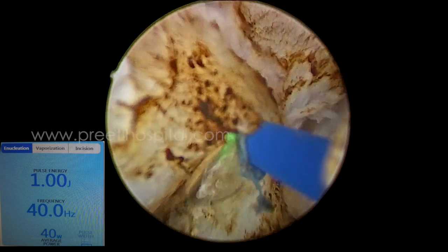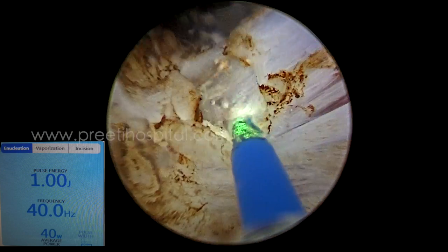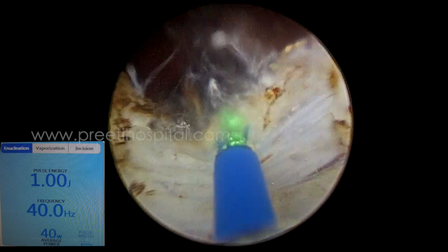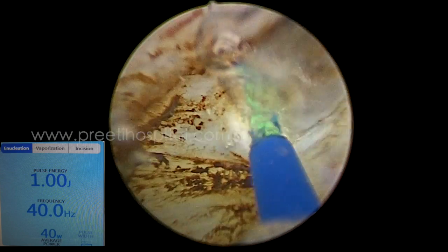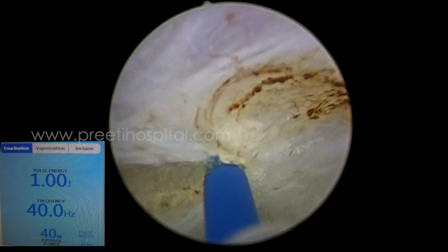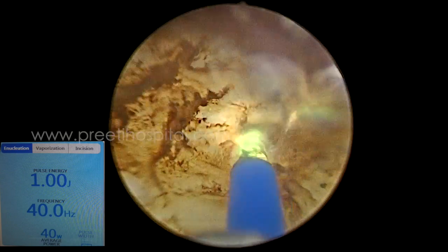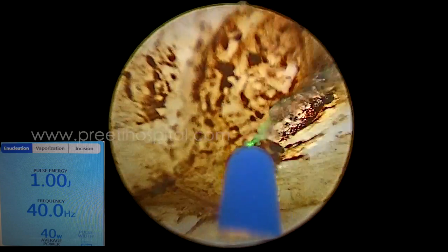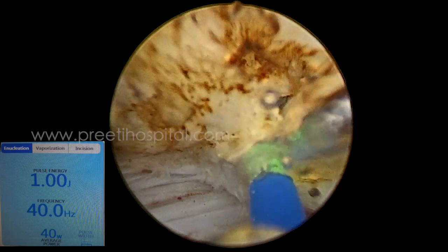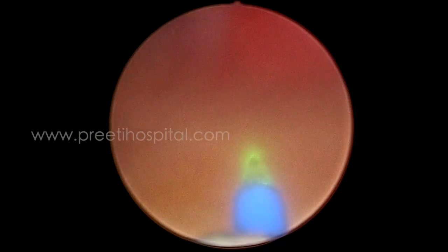During that process the prostate was hanging into the lumen of the bladder. This is the area of the bladder neck, now very closely coming at the 6 o'clock position. We are just taking out the edge like this, and at the end we were tracing the mucosa. Instead of staying close to the gland, we went close to the mucosa and unknowingly entered into the trigone.